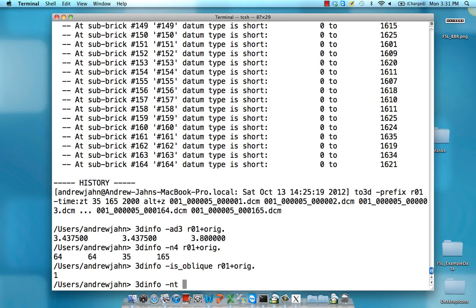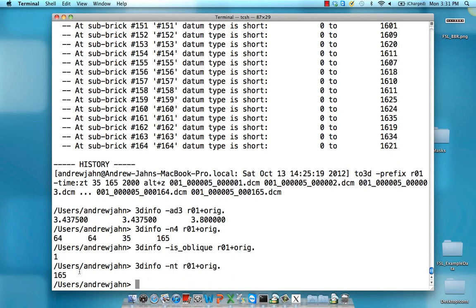If you want information about the number of time points or volumes, just type in the -nt command, and this will return a single number, the number of volumes or time points in that dataset. You can see why this would be useful in things like if-then statements.